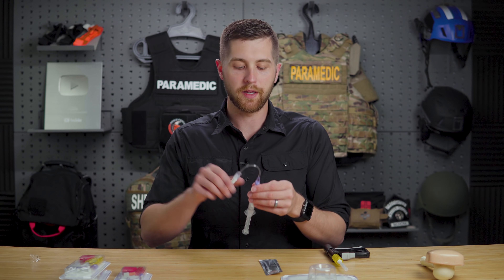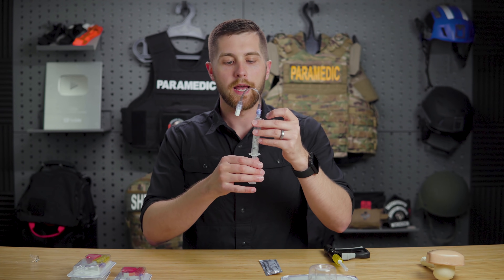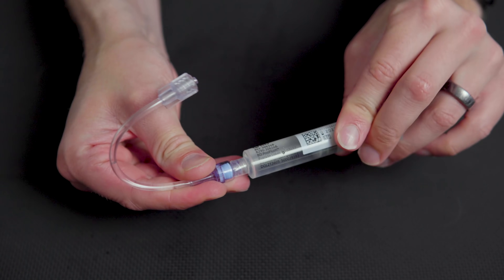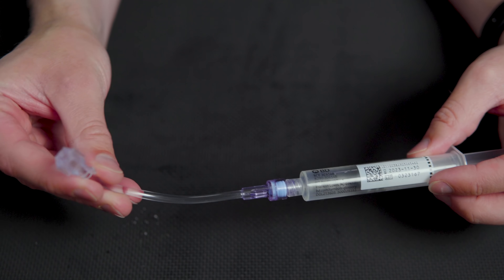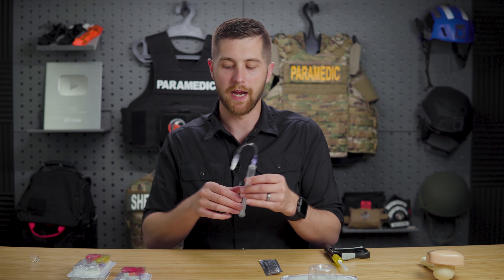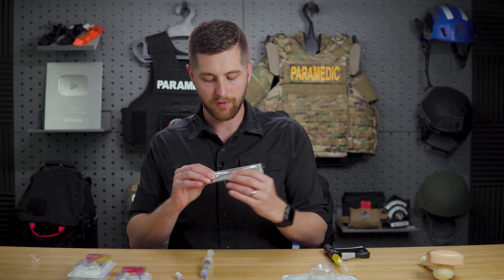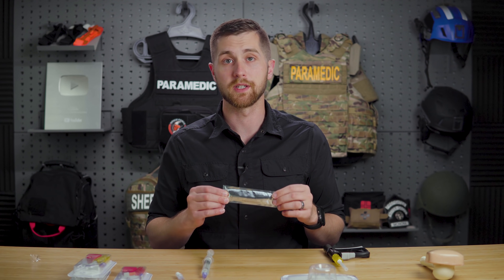Next, you need a loop and a flush. The loop comes with the packaging. I'm going to connect a flush — I don't want to touch either end because they're both sterile. I'll flush saline through it until it comes out the other end, ensuring I'm not giving an air embolism. Don't flush air into that vascular space. To clean the site, I have a chloroprep swab — chlorhexidine works really well. Use whatever your facility recommends, whether an alcohol swab, chloroprep, or another agent.